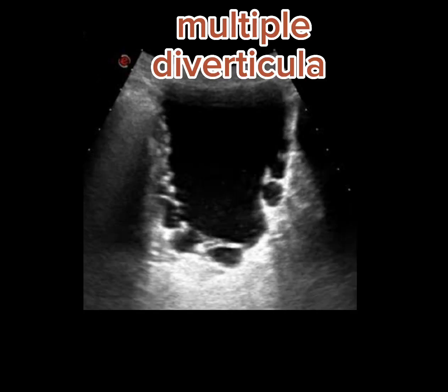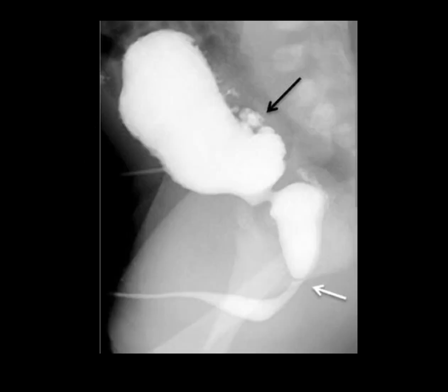Another example where we can see a thick trabeculated walled urinary bladder studded with multiple small diverticula. This is an example of a voiding cystourethrogram, where a white arrow indicates a posterior urethral valve with dilated posterior urethra, and a black arrow indicates small diverticula along the lower posterior wall of the urinary bladder.